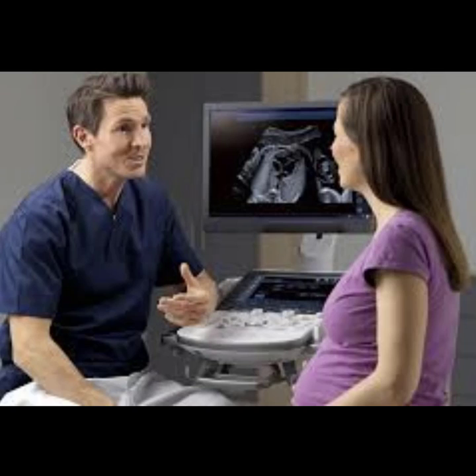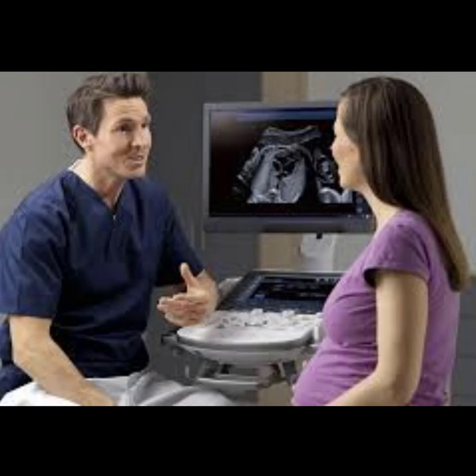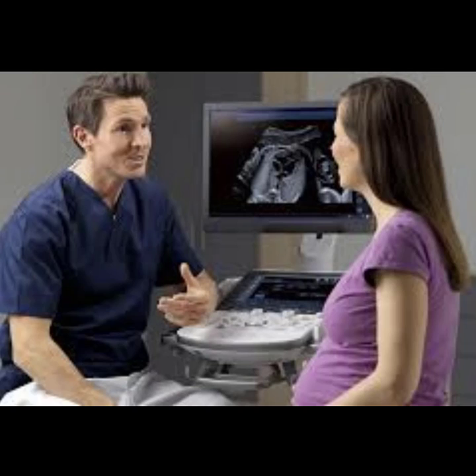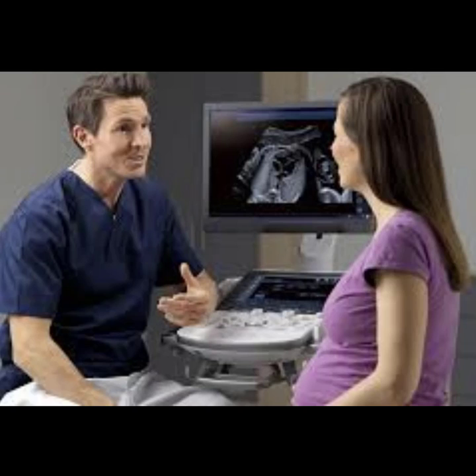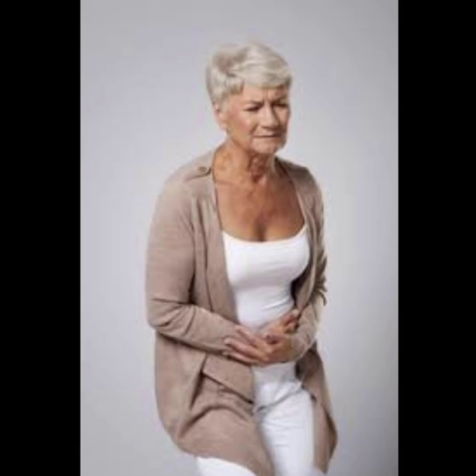Ask them to have a seat on the bed or the chair. Confirm their identity with two patient identifiers like their full name and date of birth. Also confirm what test you are doing and the doctor that will get the results, who is usually the ordering provider. Take a seat near them to have your conversation. Avoid multitasking.